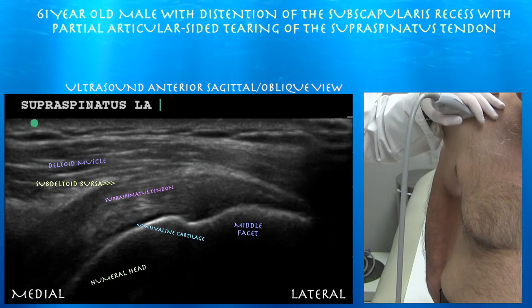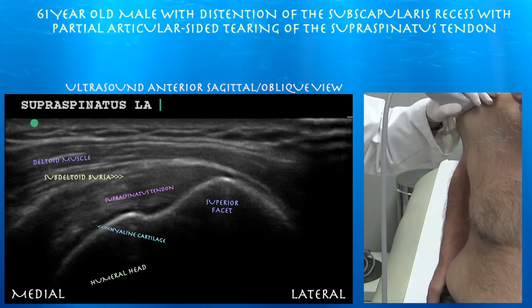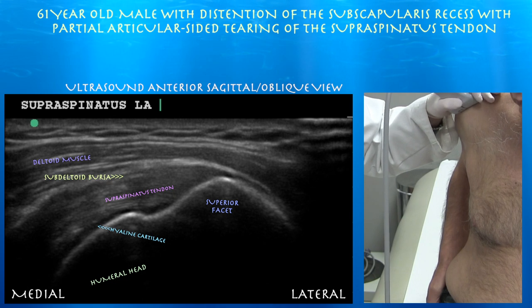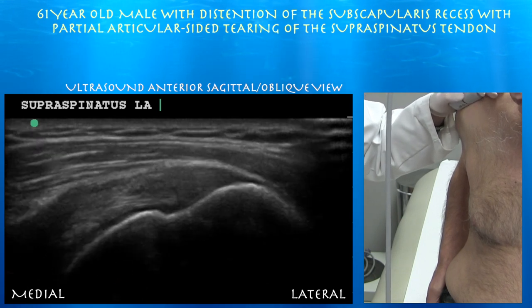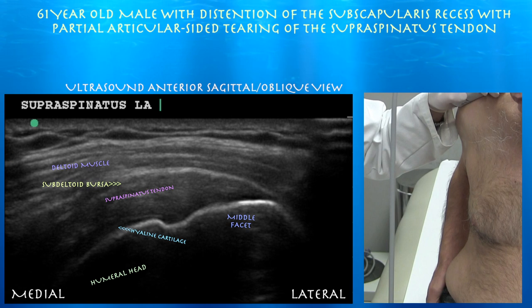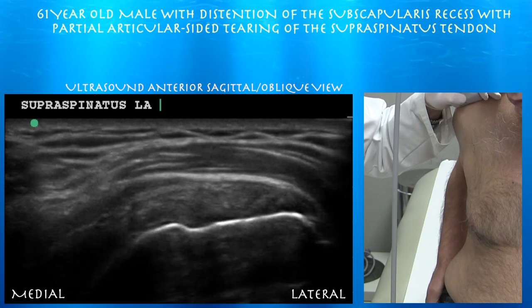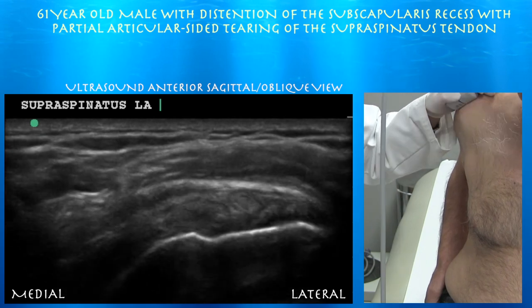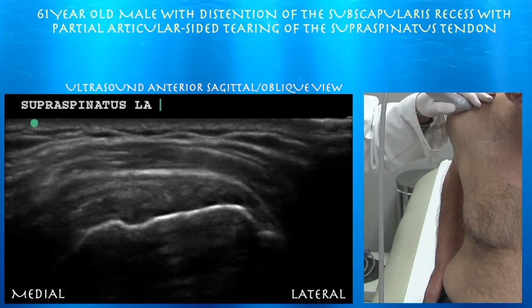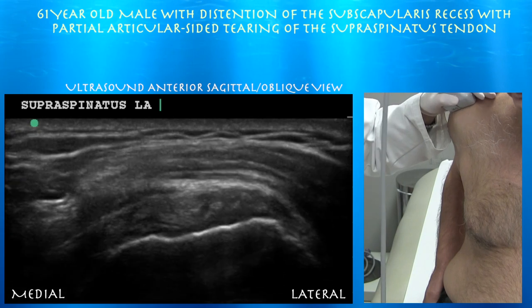Here you can see posteriorly how it's inserting into the middle facet, which is flatter than the superior facet. At this view we really don't see any tears in the supraspinatus tendon even at the anterior distal tendon. Here's that flattened middle facet as you go posteriorly. Essentially the very distal anterior supraspinatus tendon did show some signs suggestive of partial articular-side tearing, but it certainly doesn't look like a full thickness tear based on ultrasound, which is good.